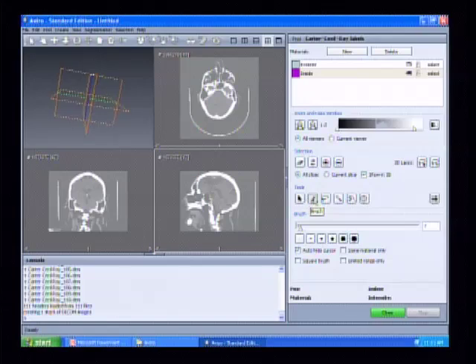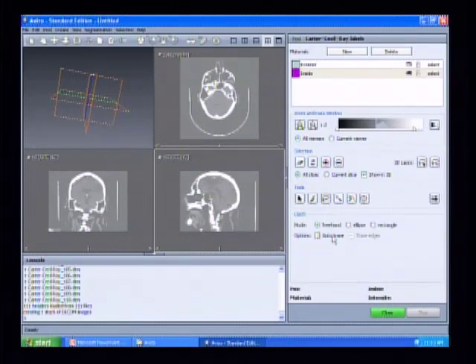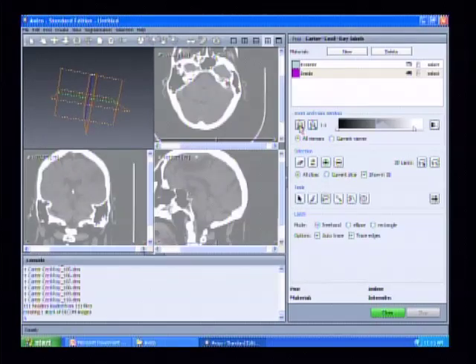You also have what they call the lasso tool. The lasso tool is pretty convenient because it will actually auto-trace along the edges of similar pixels. If you select the lasso tool, I always use this auto-trace option. It's the best when you're doing this lasso. You can click in one area, and maybe I should zoom in.